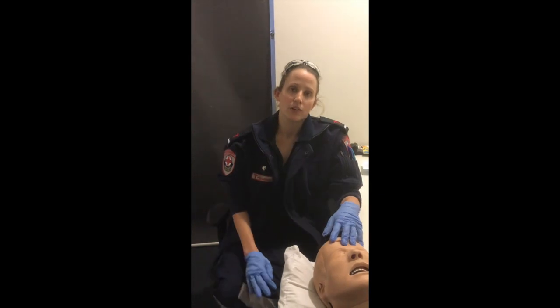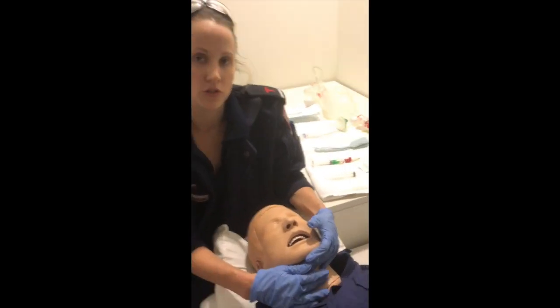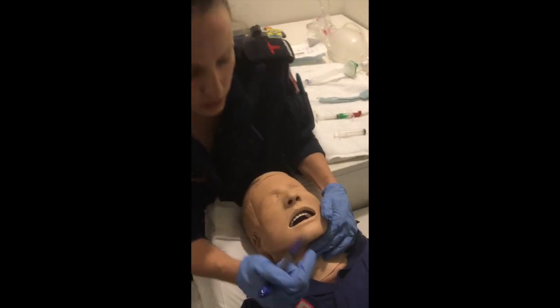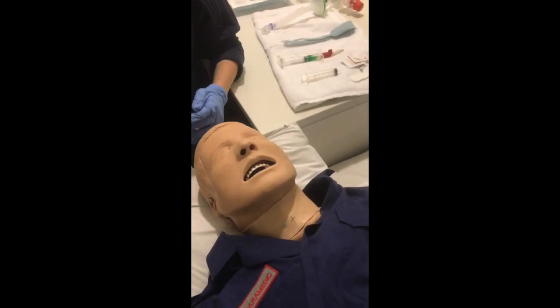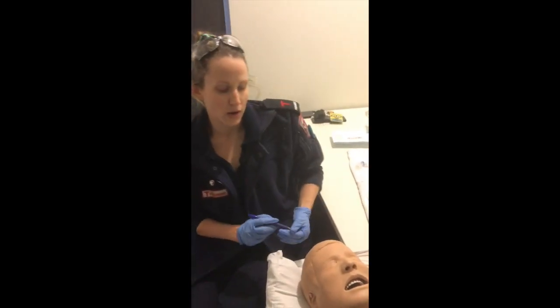So you want to identify your thyroid and cricoid cartilage, and between this is where you would find your cricothyroid membrane. So you would ideally want to mark this with a horizontal line. Ideally you would double check this with another operator and have this confirmed prior to commencing.